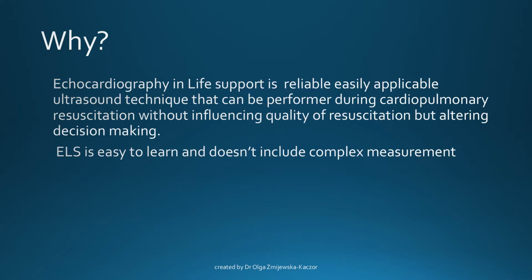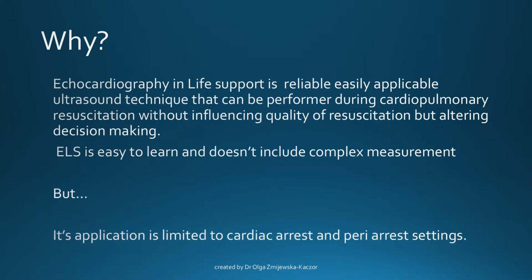So why do I think core echocardiography is important? Well, because it will help you to make the right decisions when your patient is in cardiac arrest or deteriorating. It's also an easily applicable ultrasound technique that can be learned very quickly by a base level doctor. ELS does not require complex measurements, but because it's so simple, its application is limited to cardiac arrest, deteriorating patients and peri-arrest settings.